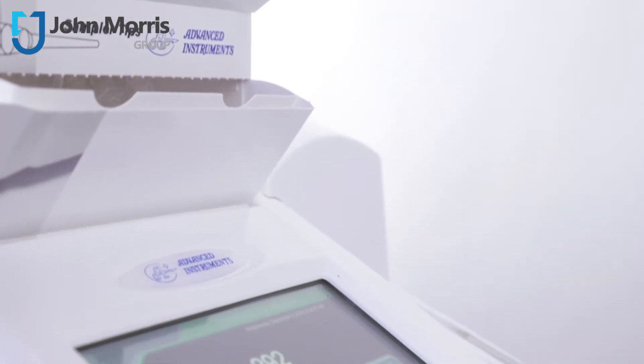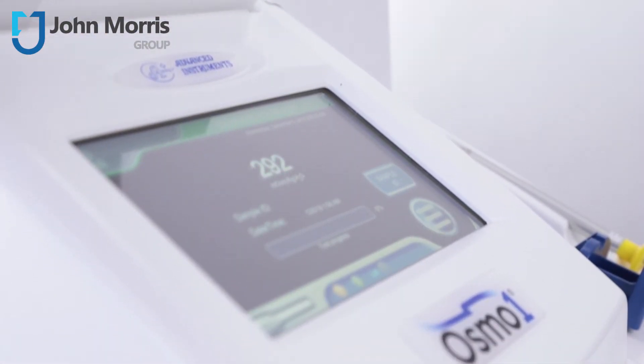Hi, I'm Andre from the John Morris Group, and today we're here to talk about the latest osmometer innovation from Advanced Instruments — the Osmo One. The Osmo One from Advanced Instruments is perfect for aqueous samples in clinical laboratories that test small sample volumes.